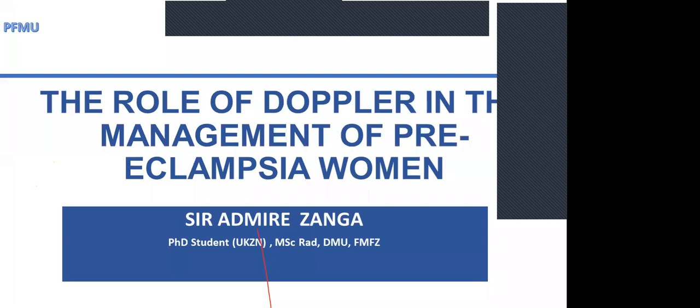Okay, Mr. Zanga, thank you so much for the powerful and enigmatic presentation. I have a simple question. When we are assessing the umbilical artery, you did say that according to the protocols we are supposed to measure at the free floating part of the umbilical artery, which is fine. But what happens when we have cases like a patient with severe oligohydramnios? In those cases, how are you doing it at the fetal medicine unit? Do you still continue to measure the umbilical artery Doppler waveform, or in that instance do you ignore it?